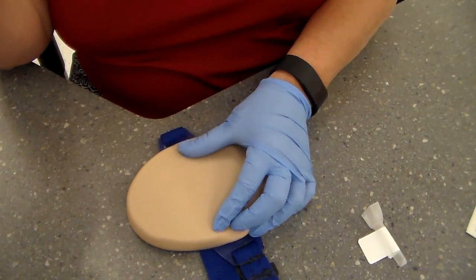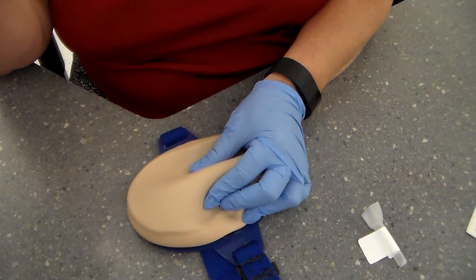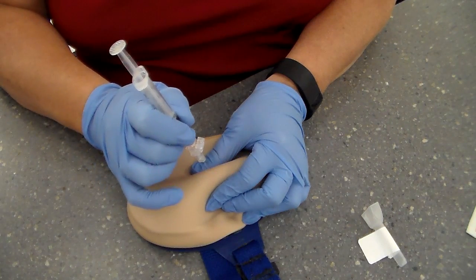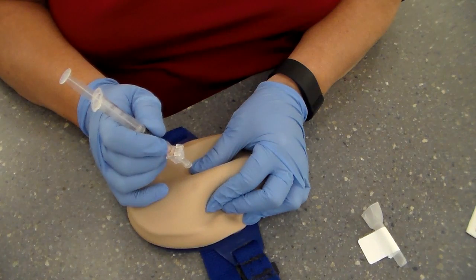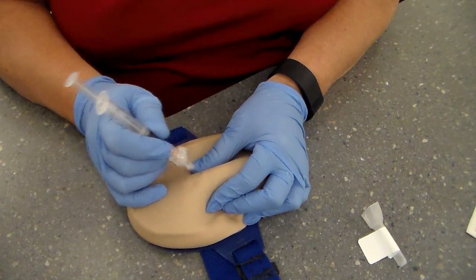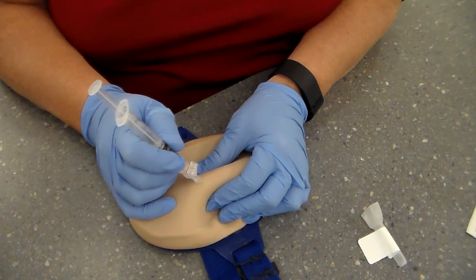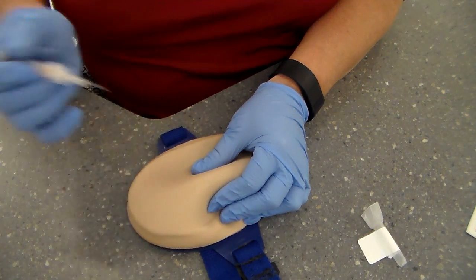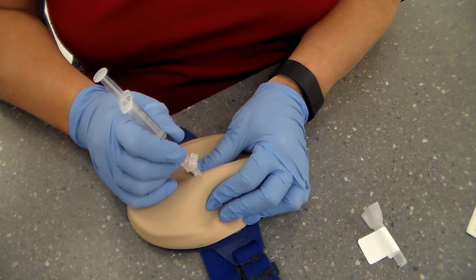Then you're going to pinch up the fatty part of your patient, of the injection site. You're going to insert the needle into your patient. Now, you're not going to go so slow that you're causing pain to the patient. You're not going to go like this and jam it into him either. It's not a dart. It really is not a dart. You're not playing darts. It's a slow and steady, quick insertion into the skin.